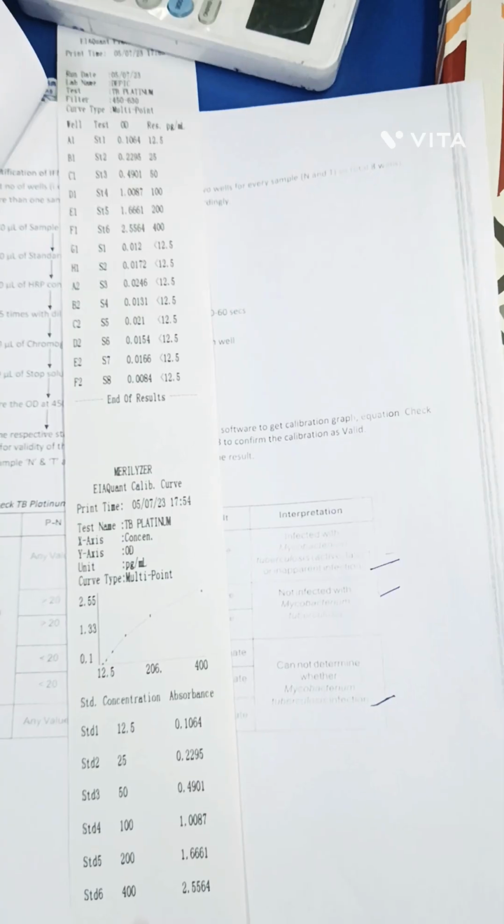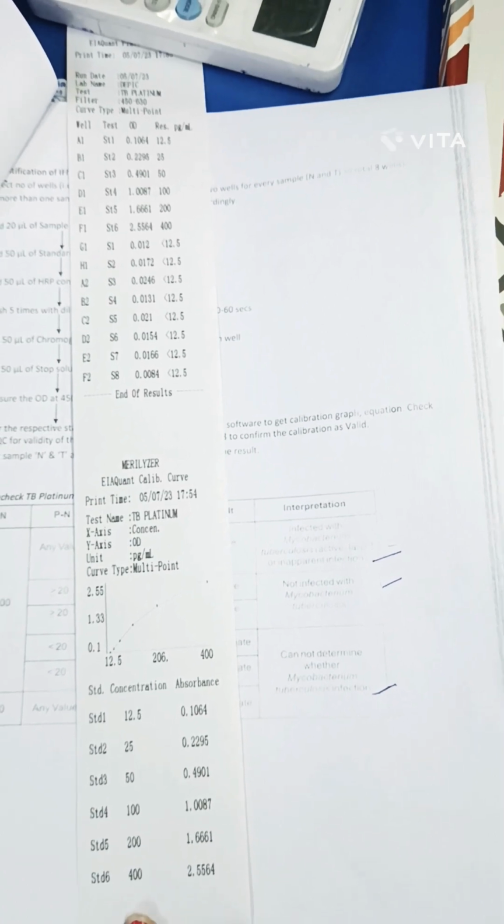Select and plot the graph. This one is our standard ODs, from 6 to 1.